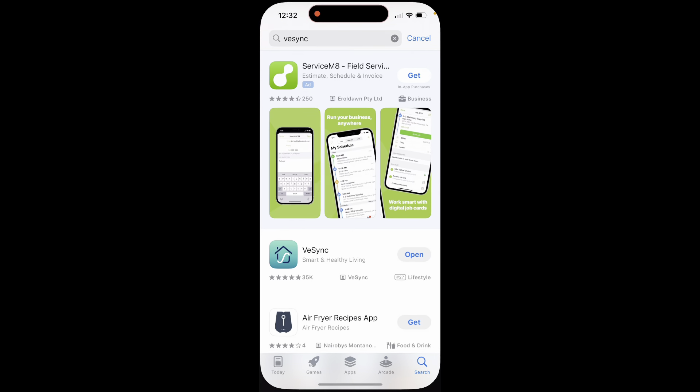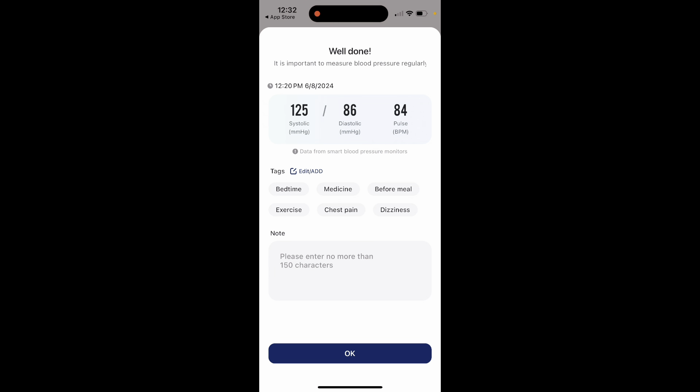So I did want to just show you the app really quick. You can see here, based on exactly what I measured, it is pulling in from the device with the exact same parameters. It has the date, time, and everything time stamped on that, which makes it really easy. And then here I can see exactly when this happened.